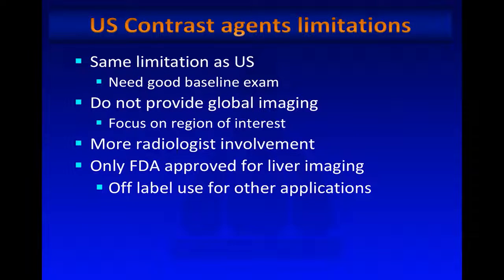You need a good baseline examination. So if the lesion or an organ is not well seen by ultrasound, it is unlikely that administering ultrasound contrast will improve visualization overall. Now, of course, it may improve resolution of a particular lesion within the organ, but if you cannot see the area of interest to begin with, this is not going to be a helpful exam.